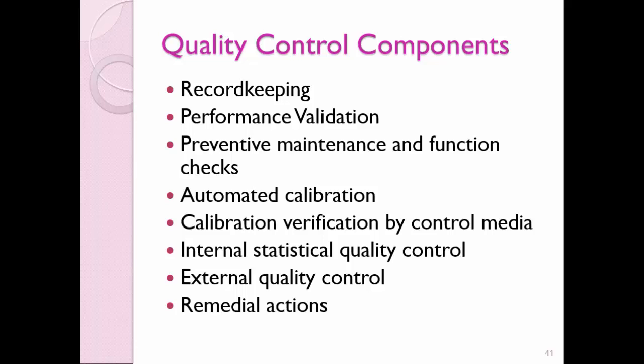So those automated calibrations also include verification by control media. In other words, that's me standing in front of the machine, putting this control media in there that I know what the values are. This is artificial blood again, but I know what the values are this time, and I'm comparing the analyzed results to what I read on the package, what the package tells me is in there. And then of course the external quality control, like I stated previously, this is that service that sends you the media without the values on it. And then the remedial actions, what are you doing about errors, things like that.